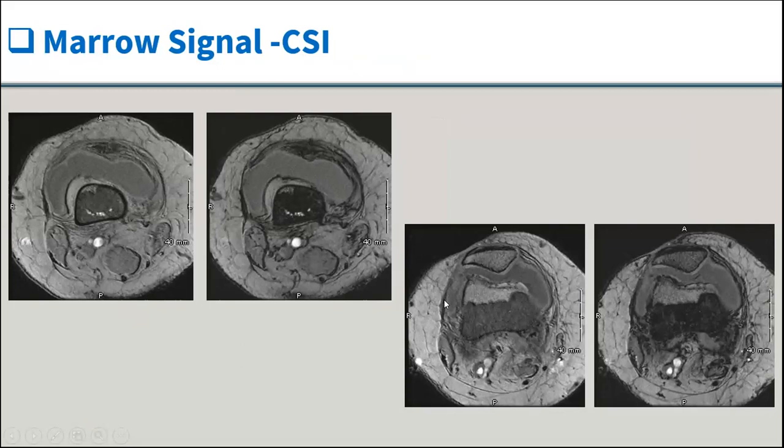So when I moved to Southwestern, I had one thing in mind. I was at JHU, and we would call these patients back randomly, like every 1 or 3 months, somebody would come up with this marrow and we would call them back for CSI and all that. And I typically don't need T1 weighted imaging. I only need it for tumors or infections. I don't need it in my ortho protocols.